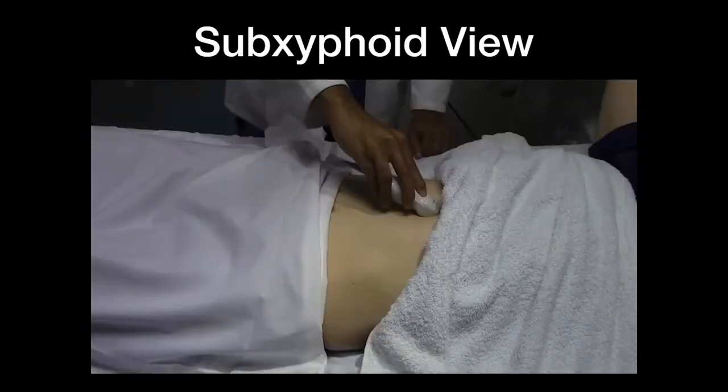Let's now move on to the subxiphoid view. As you can see from the image, the probe is placed in the subxiphoid position with the indicator, again depicted with the red dot, positioned towards the patient's right side. To obtain this view, place your hand on top of the probe in order to allow downward pressure into the subxiphoid space. Again, rest your fingers against the patient's abdomen to stabilize your hand and make fine adjustments.